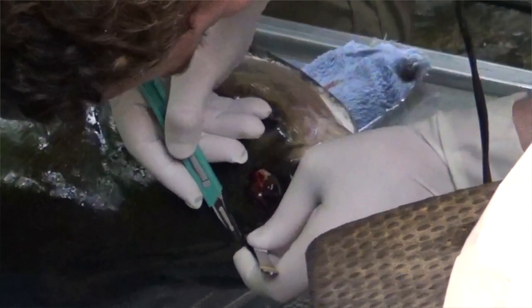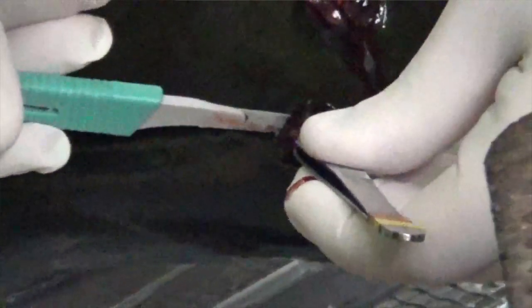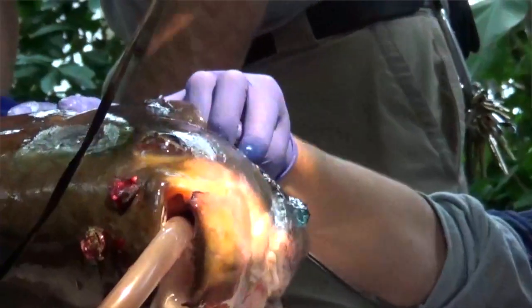Fish have a remarkable way to heal and they heal a lot more rapidly than we do as mammals. What we were able to do was remove the mass and then cauterize the rest of the mass that was there.